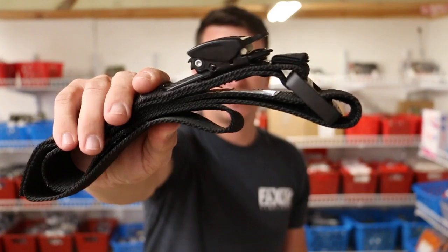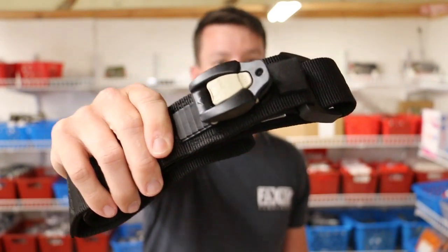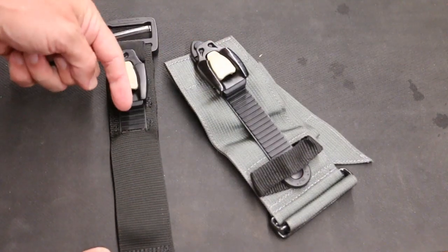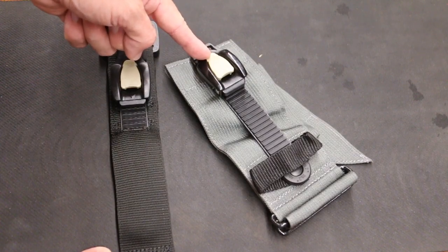I know you're like, I have seen that buckle before — and you're absolutely correct. This is the same mechanism as on the TX2 and the TX3 tourniquets, which were recently added to the TCCC recommendation list.